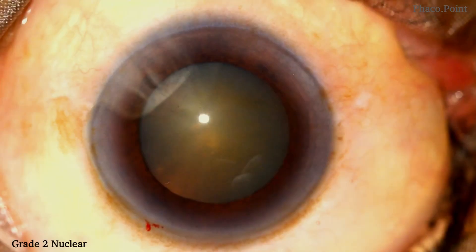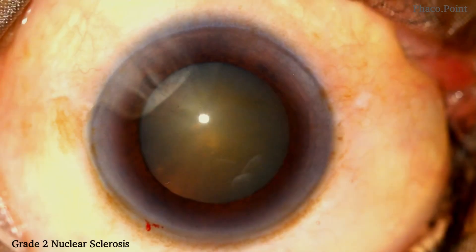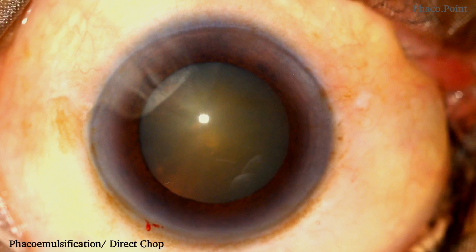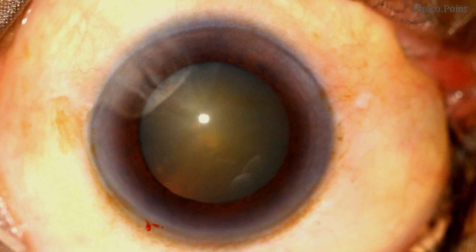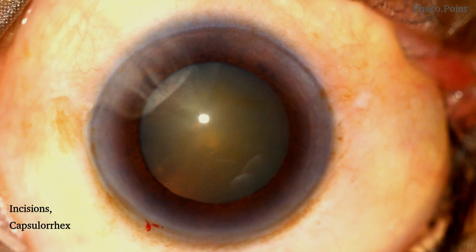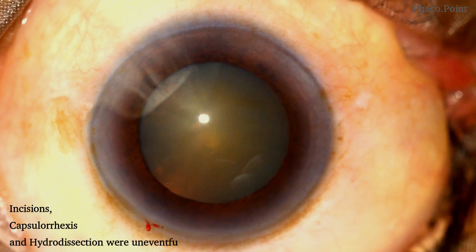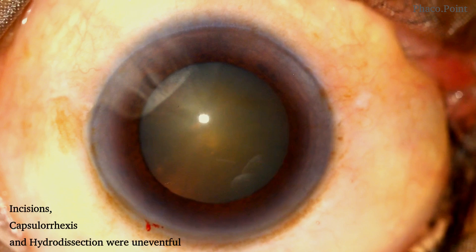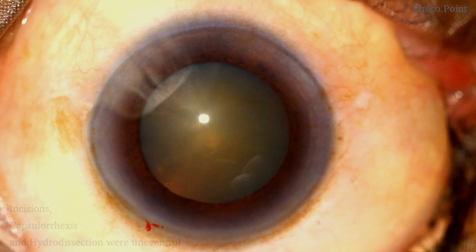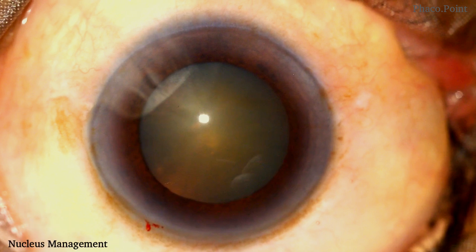This patient had a grade 2 nucleus sclerosis and was posted for phacoemulsification. The steps prior to nucleus management — the incision, the capsulorrhexis, and the hydrodissection — were uneventful. Let's get to the nucleus management.